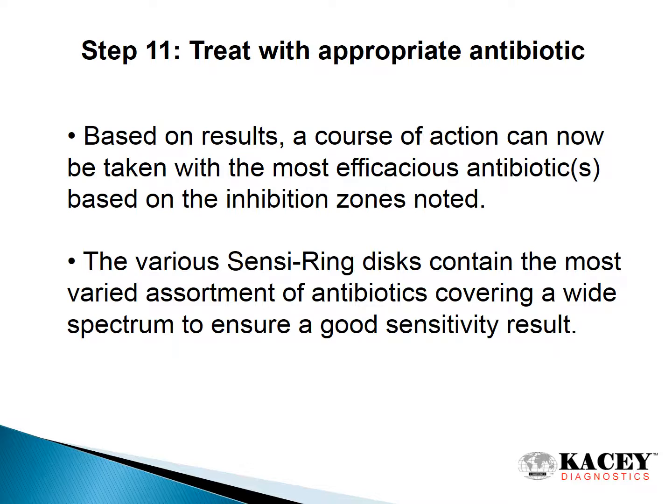Step 11. Treat with appropriate antibiotic. Based on results, a course of action can now be taken with the most efficacious antibiotics based on the inhibition zones noted. The various SensiRing discs contain the most varied assortment of antibiotics covering a wide spectrum to ensure good sensitivity results.